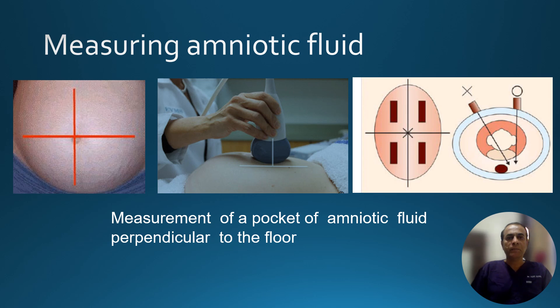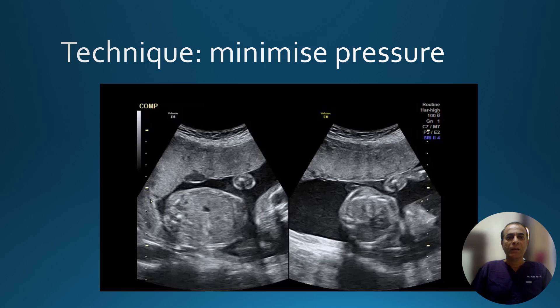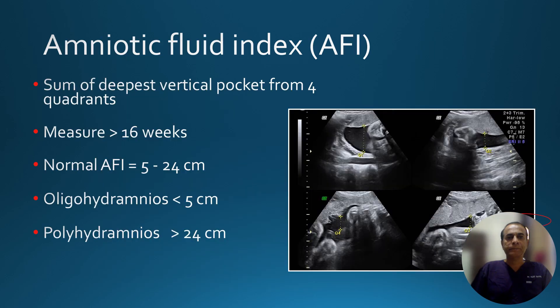Remember to keep the probe perpendicular to the floor; it should not be held at an angle, otherwise it will lead to a wrong amniotic fluid measurement. Always avoid excessive pressure over the probe — as you can see from this image, if we give excessive probe pressure, the fluid will move out, and if the probe pressure is relieved, the amniotic fluid pocket is seen nicely again.